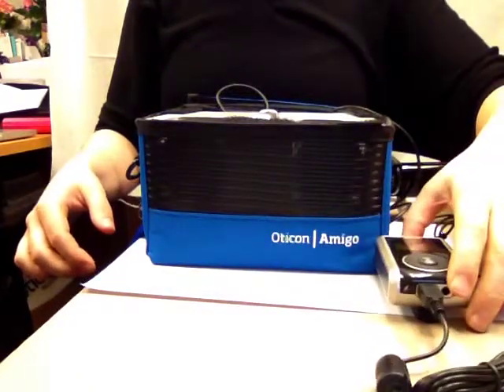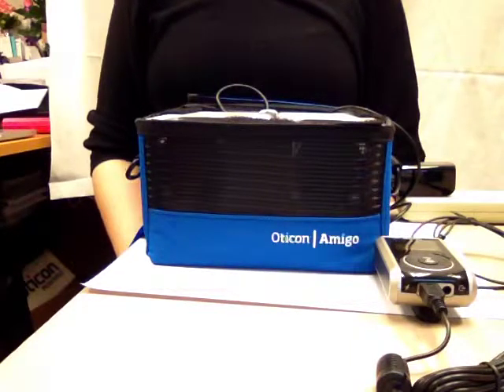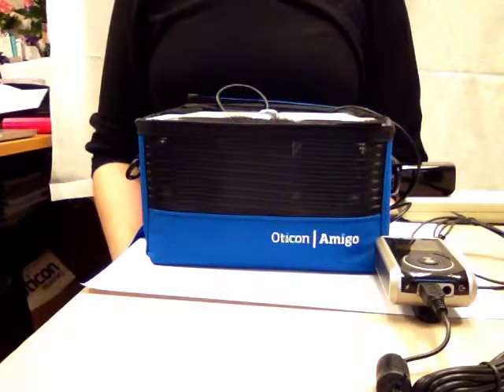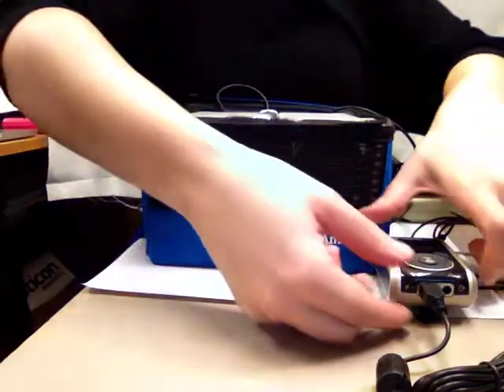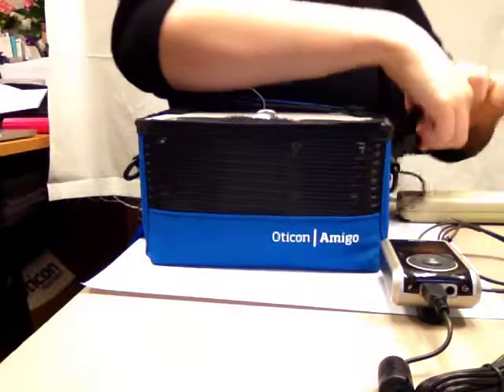Now what you'll need to do is pick a responsible person in order to check the equipment's functioning each morning. To do this, unplug the charging cords from the desktop speaker and from the transmitter.